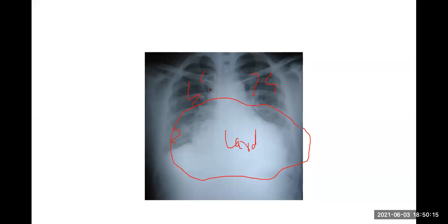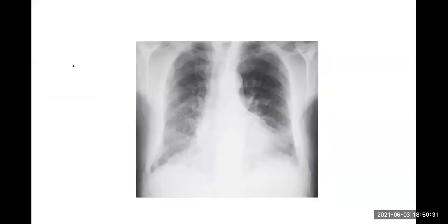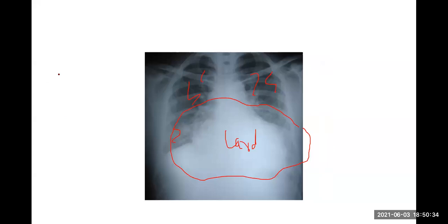Now ඔතනම ලියා ගන්න ළමයි in pulmonary edema there are some other features. මොනවද? මේ X-ray එක නම් ඒවා පේන්නේ නැහැ මම ඒවා වෙන දවසක පෙන්නන්න. What are the other features of heart failure? Of course it causes patchy sudu everywhere. But if you look carefully there are 2 other important features. One is upper lobe diversion where the blood vessels leading up to the upper lobes are more prominently marked. Upper lobe diversion.